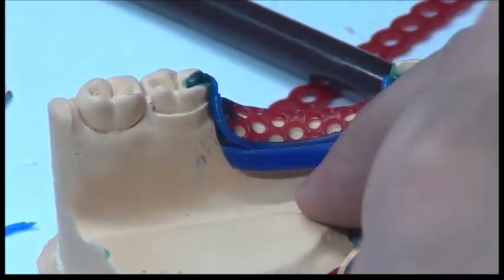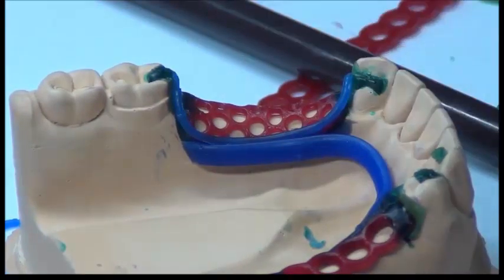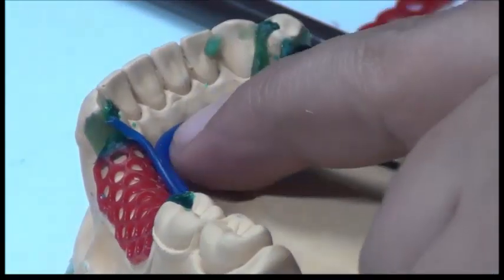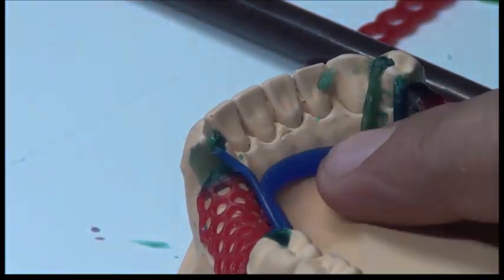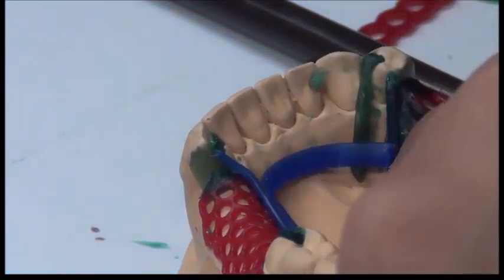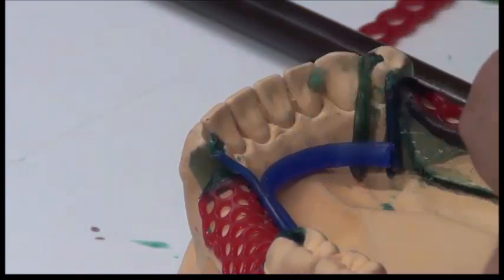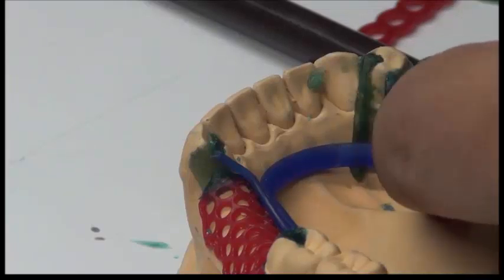It runs beneath the external finish line. It's not in the full sulcus depth. It's away from the full sulcus depth. On the anterior part, it's 4 millimeters away from the marginal gingiva of teeth. Okay? And it runs to the other side up to the external finish line. It stops here. Here in the free saddle, the whole sulcus area will be filled in with acrylic. That's why it ends here.